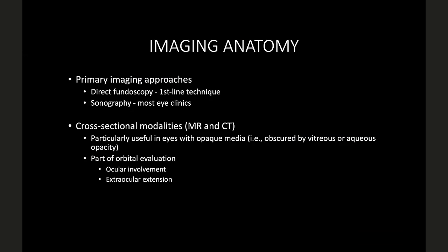So coming back to the orbit, if I'm looking for an orbital fracture or trauma, then I'm going to be going after CT. Yes, hemorrhage, CT will show. But hemorrhage is, they're all pathology. To varying degrees, they show on MR also. It's just different. CT is quicker, MR is slower. In my very first talk, I brought about the differences in these two modalities and how the limitations are for each of them. So sometimes it is nice to keep remembering and retrieving them because that is where your groundwork is. So even here for trauma and everything, order a CT.